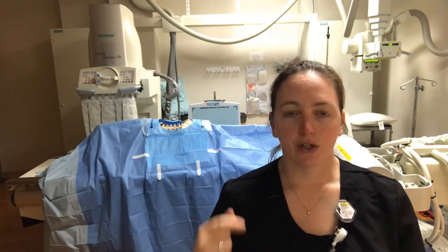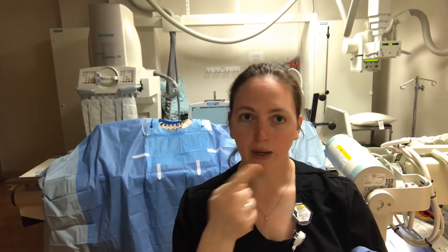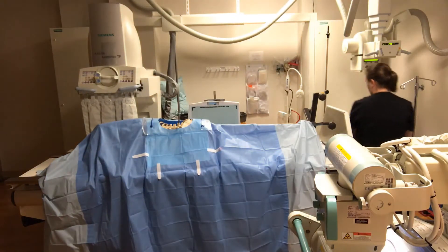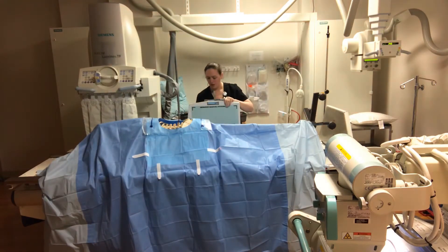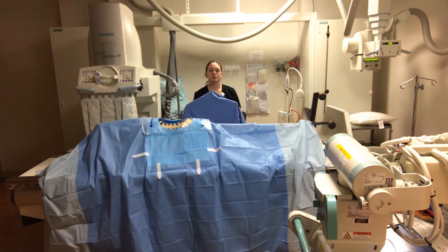You're gonna use the cassette holder — yours will be on wheels. I'll show you how to put that up. Bring your cassette around the table, put it in the holder, and then the scrub tech is going to cover it with a blue drape before you bring it up close. You're gonna wheel yours right flush against the table after your surgical tech has wrapped it with a blue sterile drape.